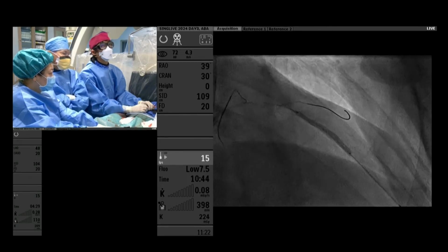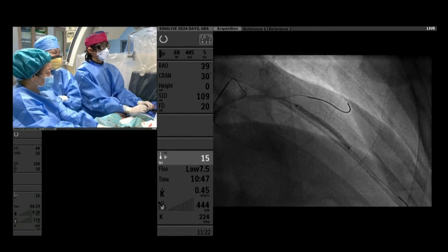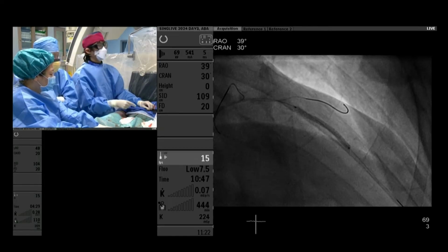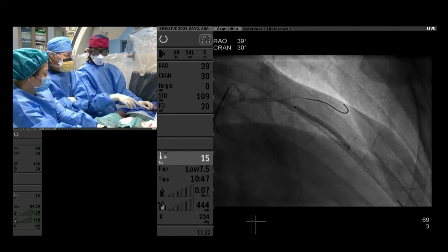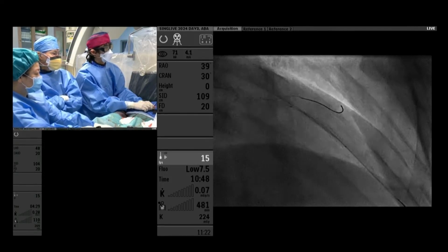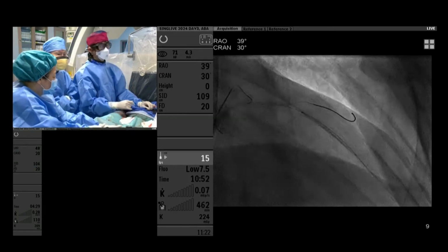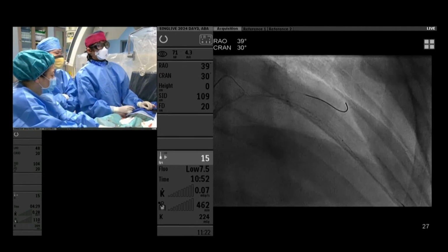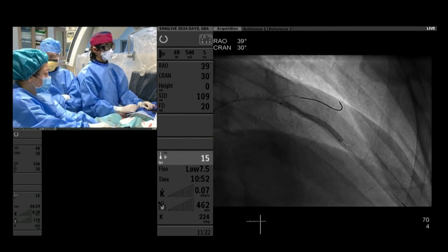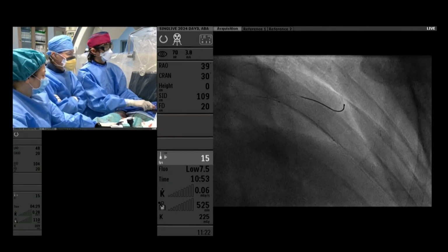Not quite so in this case. I think it's just one of those stents that we can use. Of course, if you have a very high bleeding risk, then it will be very helpful. What sort of stents would you think would be best in this kind of CKD situation? I'm not quite sure if there's a preference per se. The stent I would choose would be guided by post-PCI DAPT, and this patient is presumably at some degree of high bleeding risk. So, yes, I think this is a good choice.